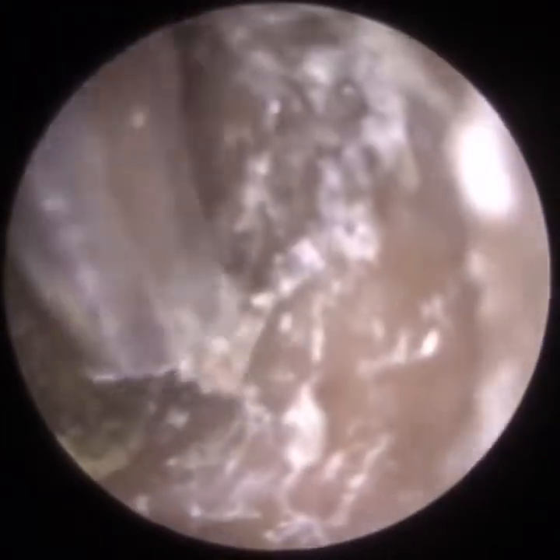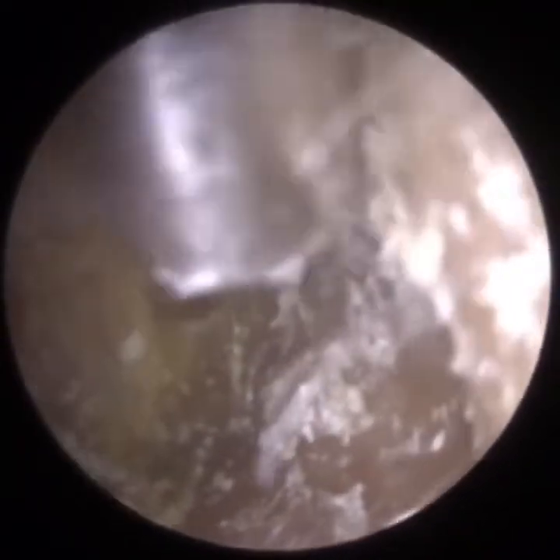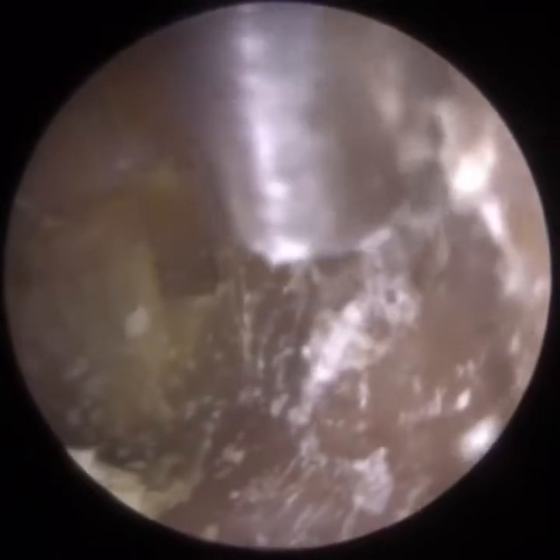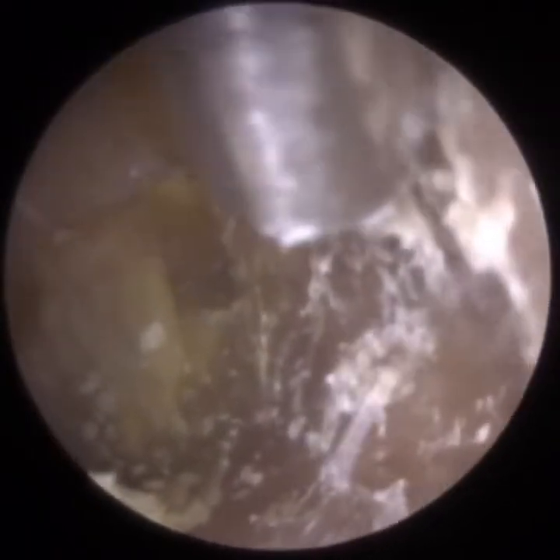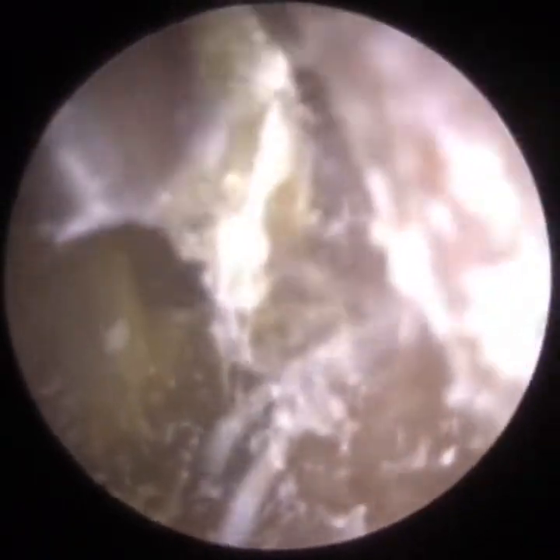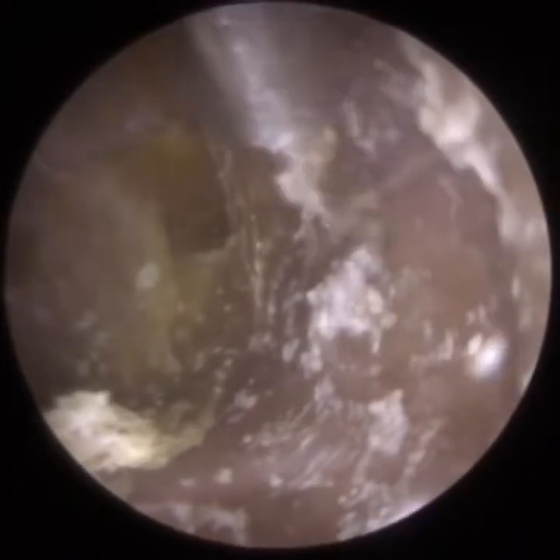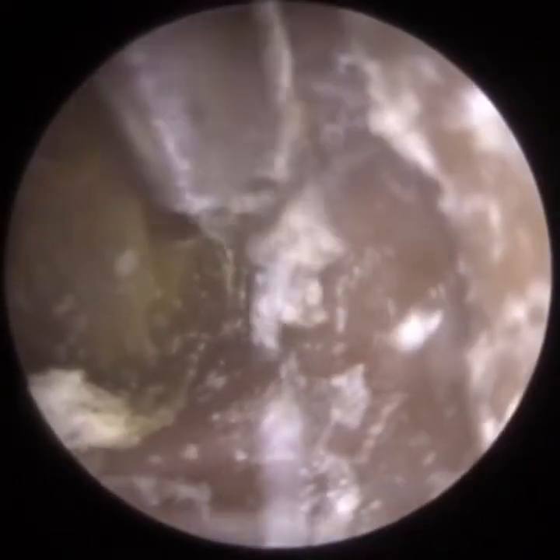So I'm just using the suction probe, just trying to lift this off the canal wall, and this crusted skin, it's adhered itself all the way around the patient's ear canal and also on the eardrum. So in a moment after I remove it, you'll see the shape of it. It's taking the shape of the patient's ear canal. And it is quite tricky because it's really hardened and crusted. And I'm going to revert to forceps in a moment.